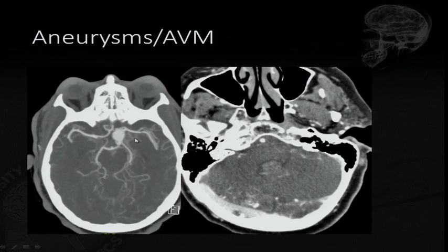Aneurysms, I mean, this one that anyone can pick up, that's the one you're going to be looking for, okay? Not the 3 millimeter, 2 millimeter aneurysm. Not in the control booth. And again, AVMs. If you catch them, just tell them.